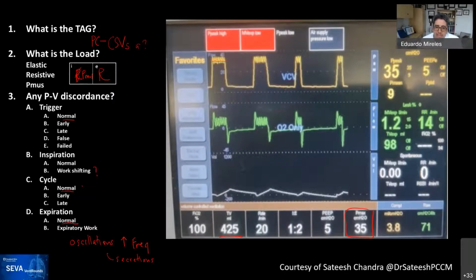So I presume that what we're dealing with is some sort of a dual targeting system in which it's the Pmax, and it changes from flow to a pressure controller once you have reached that peak pressure, which we know that Draeger does.